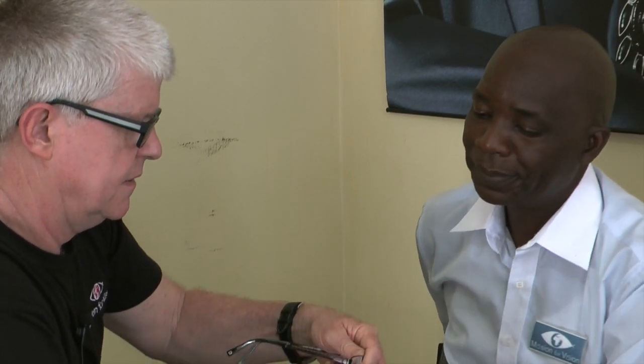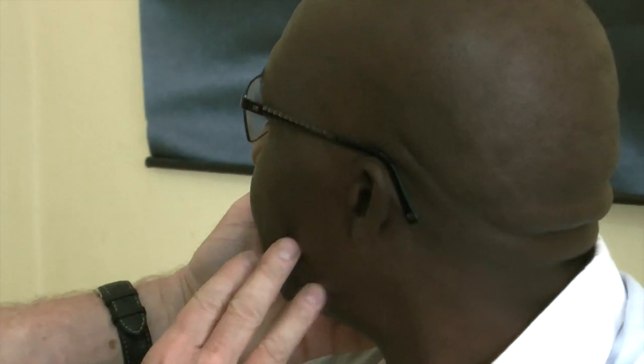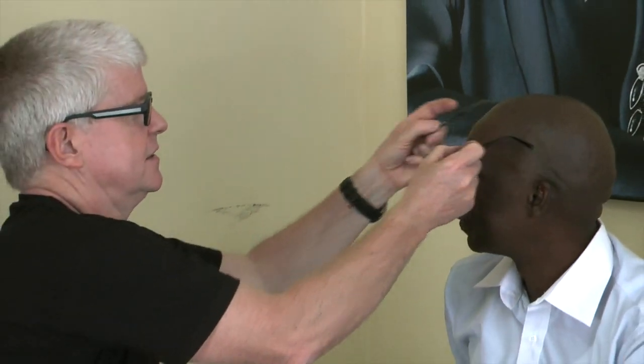I'd need to do a little bit more — I think I've overdone it slightly, just a little tiny bit. But I think we are now ending up with a frame that actually is a really good fitting frame. The pads are fitting correctly on the nose, the side lengths are the correct length, they're sitting nice and down, the bend is correct. That angle is good. So I would be very happy with that, and the patient would be very happy to have a pair of glasses that fitted like that — that was comfortable. Do they feel comfortable, Remy?